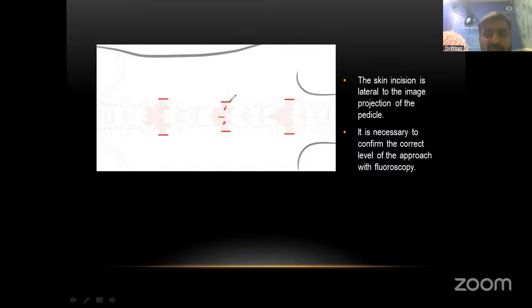But it depends upon two things. One, before doing surgery, you have to do fluoroscopy to see the level and where we should give the incision.